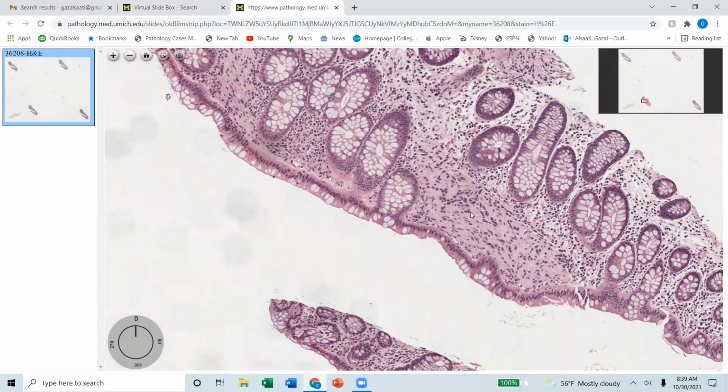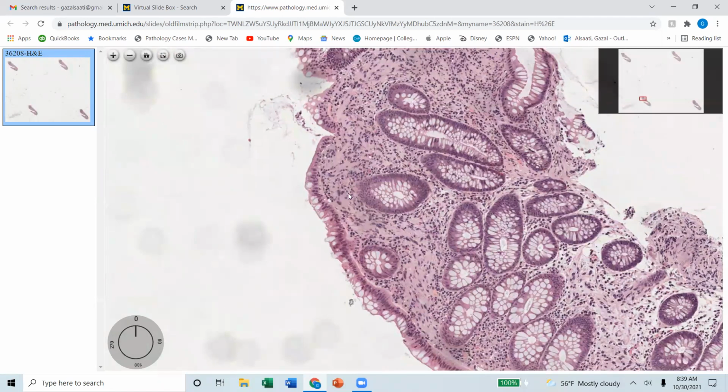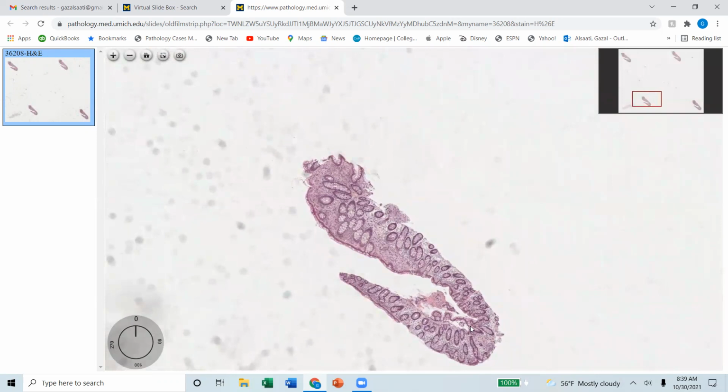It's just some pinkish material underneath the lamina propria. And my trick about this, because really it's very difficult if it's a small biopsy. I mean, you will basically have just this area here. My trick about it is I go on low power. I look, I know this is all normal. And then I see here, I feel like it's busier, okay?